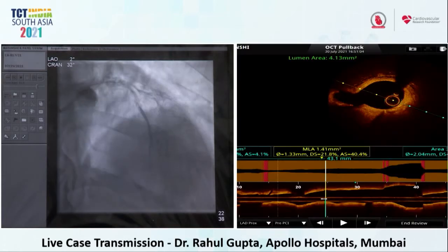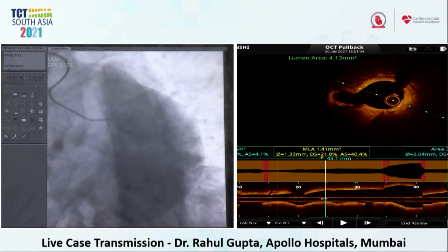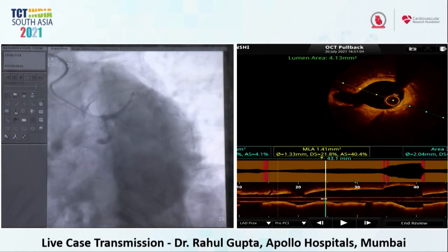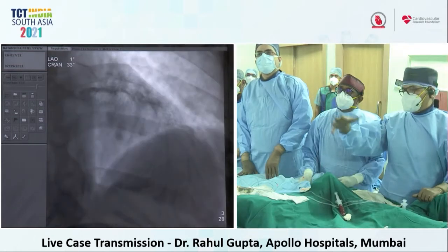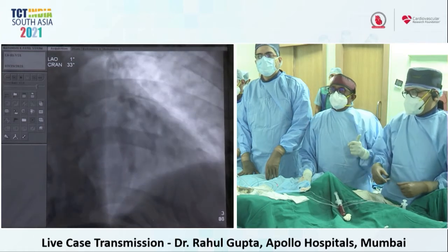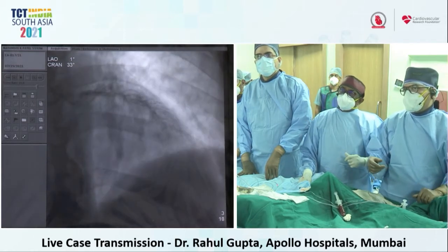Dr. Rahul, do we have an angio co-registration? Yes, we have angio co-registration, but because this is connected to the live case, we can't. The angio correlation doesn't happen when we have the live case because the input has been taken, output has been taken for that.